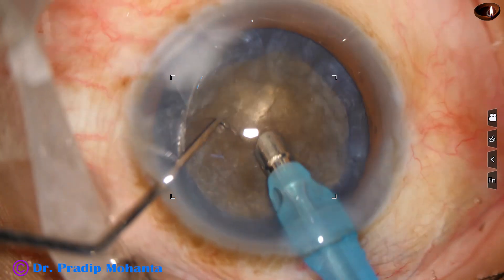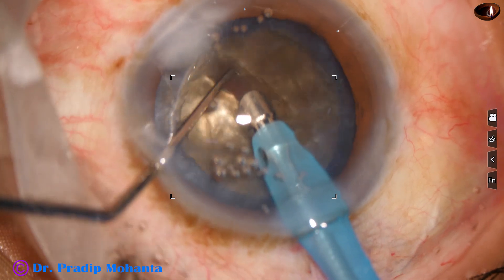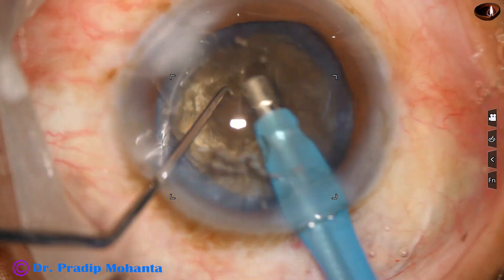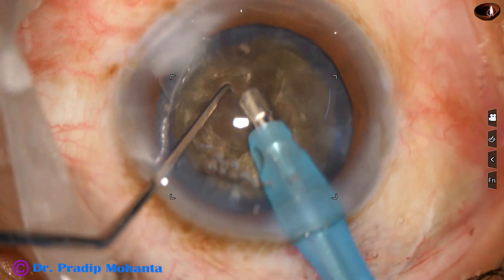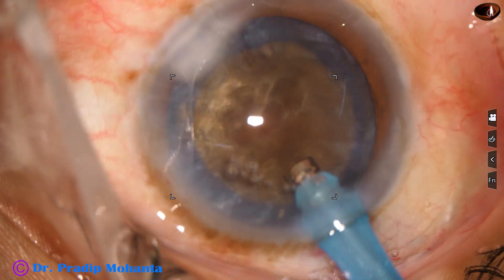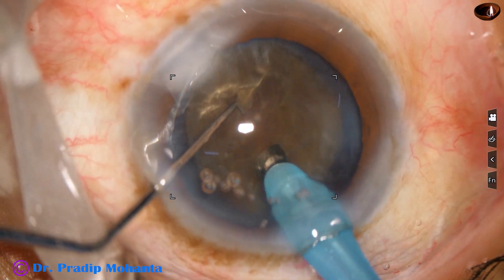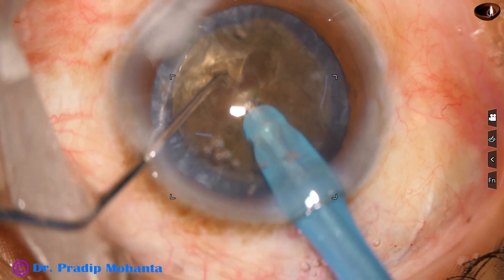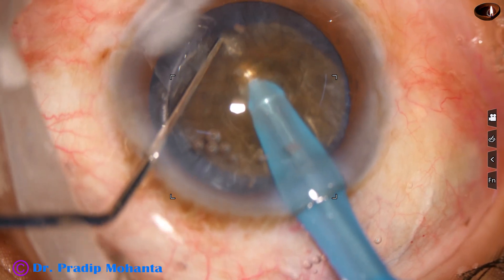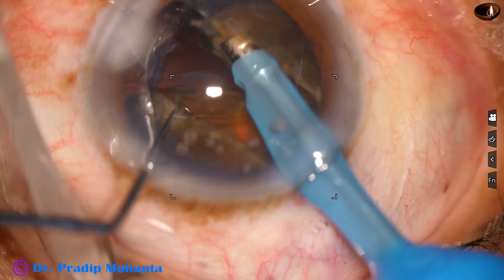Now I am going to manage this nucleus by my technique, which I call submarine chop. The phaco needle goes in, some superficial lens matter is removed so that you can judge the depth of the phaco needle inside the nucleus. The bevel is up towards the cornea, nucleus is pushed a little down. The tip is buried into the substance of the nucleus just in front of the main incision, goes through the nucleus towards the opposite equator, and the nucleus is chopped. A nice crack is achieved.